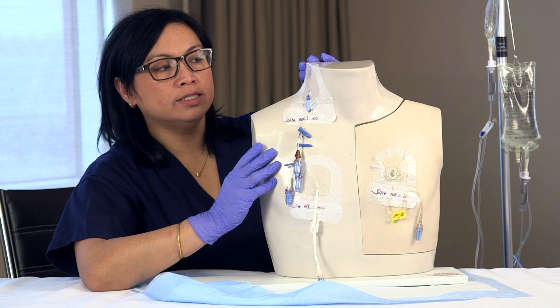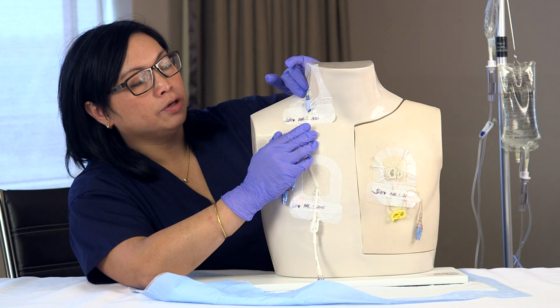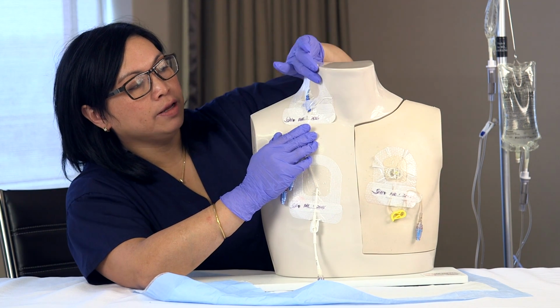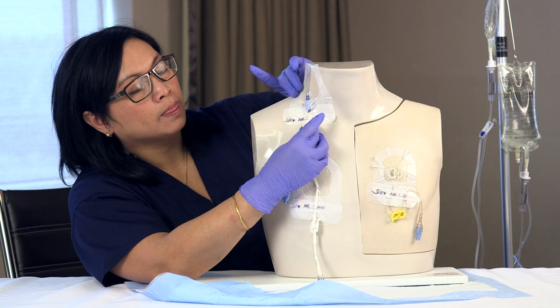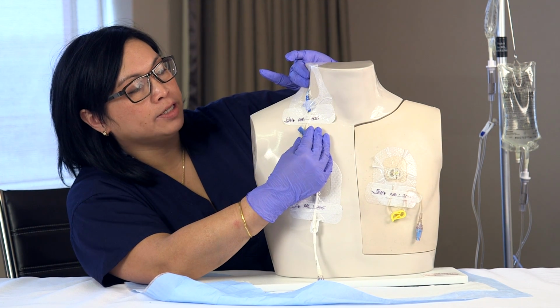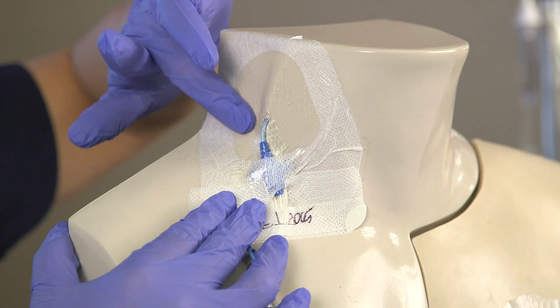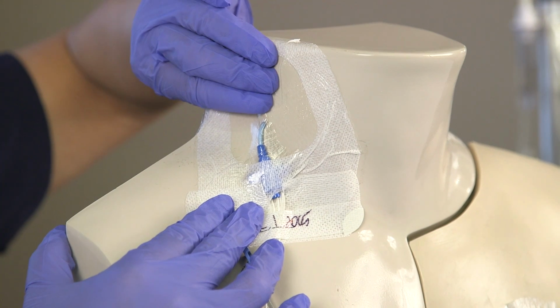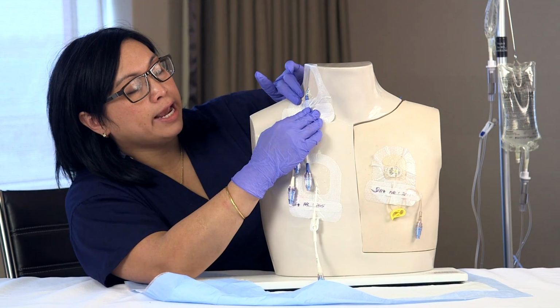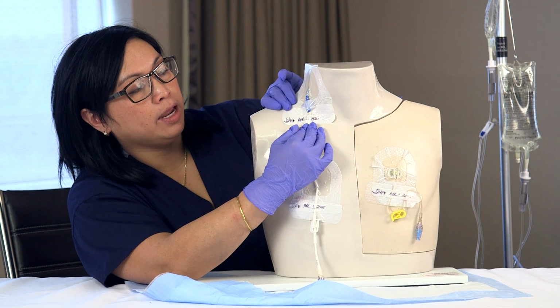So now for the lines in the neck, you want to do the same thing, looking at the site and ensuring that the dressing is dry and intact at all the edges. You want to gently palpate at the insertion site, looking for oozing, redness, or drainage, and moving up along the vein path as well as down, asking the patient if they can respond if there's any pain or tenderness.